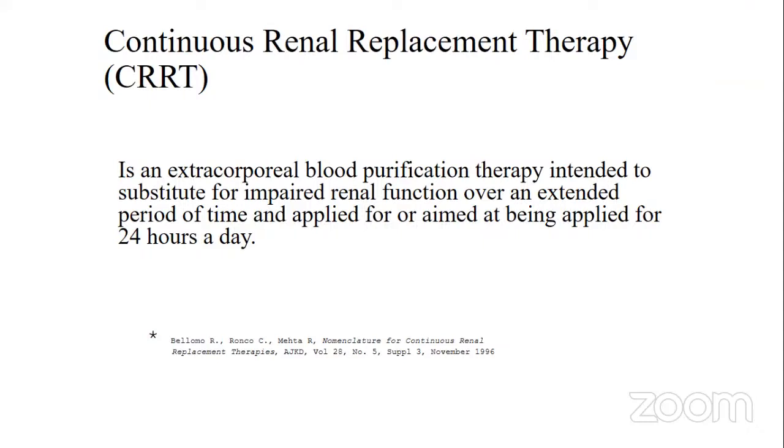It is continuous because it is done over a period of 24 hours. That is the reason we call it continuous renal replacement therapy. The terminology has now changed to continuous kidney replacement therapy.